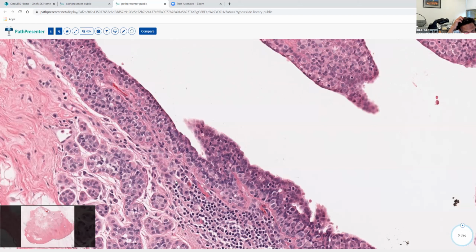So if, on the other hand, in a biopsy all you see is ducts with some sort of Pagetoid involvement by neoplastic cells, while that could be a presentation of LCIS, it's a good idea to do E-cadherin stain, because this is an unusual presentation, right? So the E-cadherin stain will tell you that this is not pure LCIS.